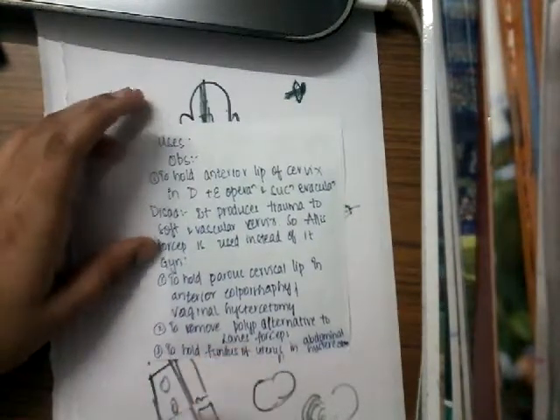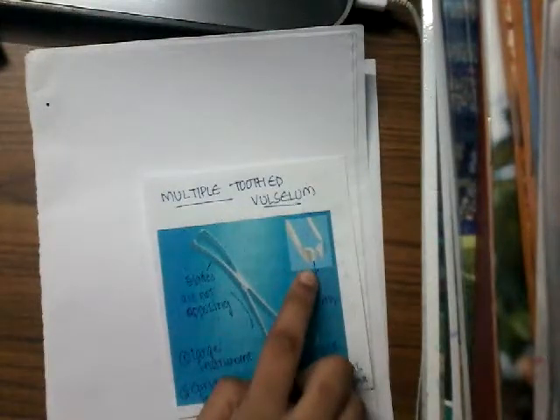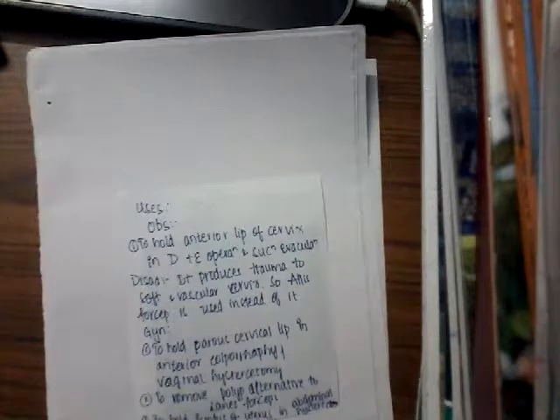The uses of multiple tooth valsellum include obstetric and gynecological uses. The obstetric uses: since it has teeth at the tip, it is used to hold structures. Specifically, it is used to hold the anterior lip of the cervix in dilatation and evacuation (D&E) and suction evacuation. However, the disadvantage is that in D&E it produces trauma to the soft and vascular cervix. For this reason, we instead use Alice forceps for holding the anterior lip of the cervix in dilatation and evacuation.